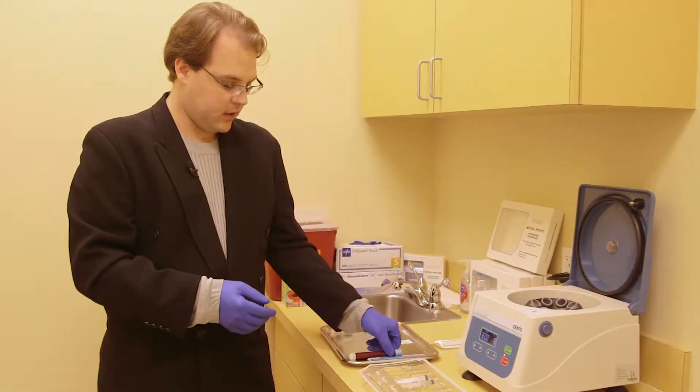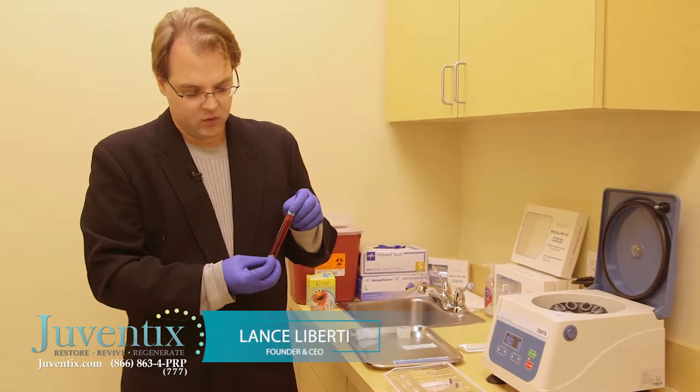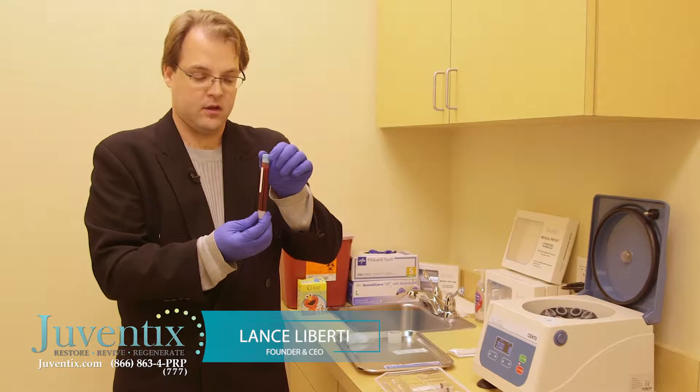The particular patient we're working on here today has a rotator cuff tear of his right shoulder. Because we're only doing one large injection, we'll need to process one vial of blood.